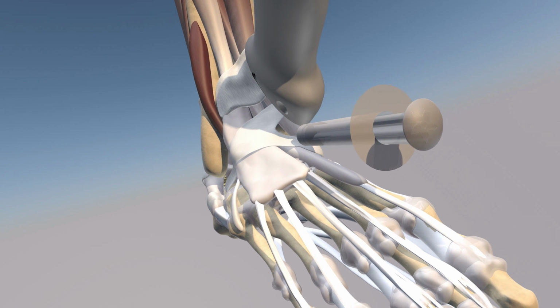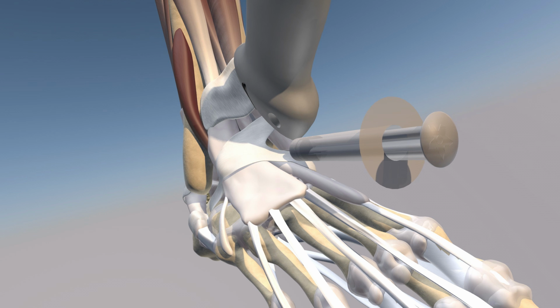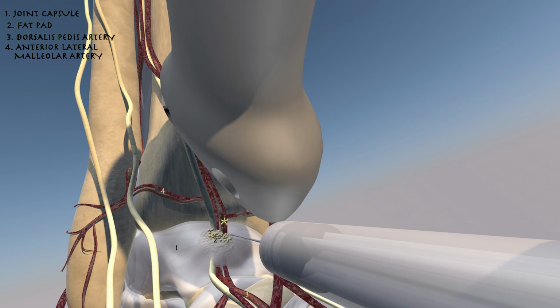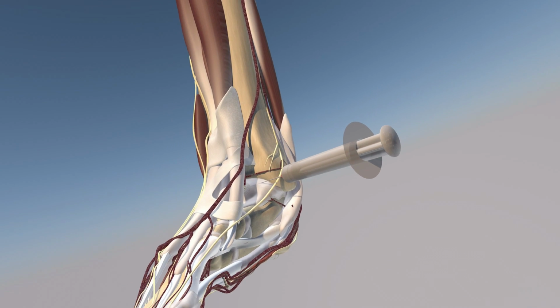Here we're going to go over an ankle joint injection. This is an in-plane approach. We are essentially trying to get the needle between the tibialis anterior tendon and the extensor hallucis longus tendon. Here you can see the needle going just medial to the dorsalis pedis artery. This depiction, unfortunately, is inaccurate: the artery does not go intracapsular, and the fat pad also does not go outside the capsule, as this image depicts.